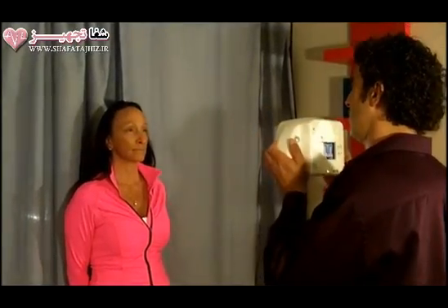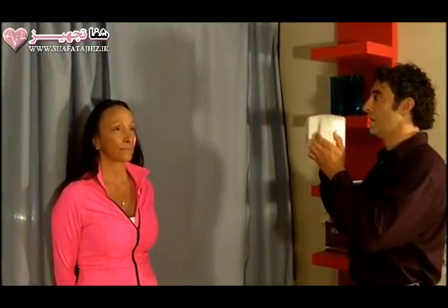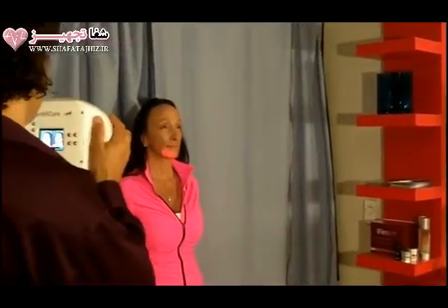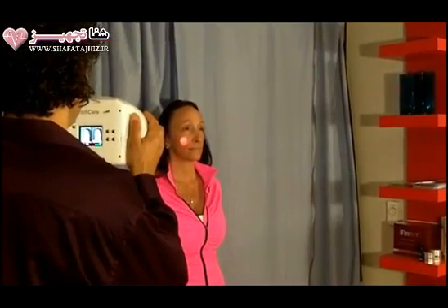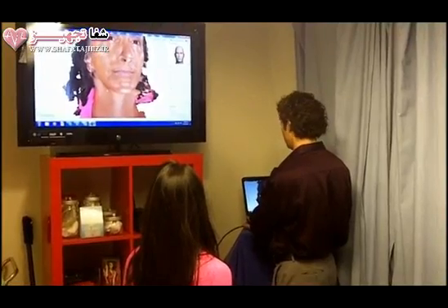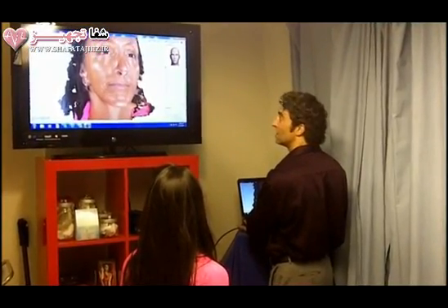There's just 4 separate views, and that red dot I focus in those 4 different areas, and it's very easy to do. There's 2 dots, you line them up so there's one single dot, and then I take those images and create a 3D view from the intuitive software. It's very easy to do, and I get the image in just minutes.